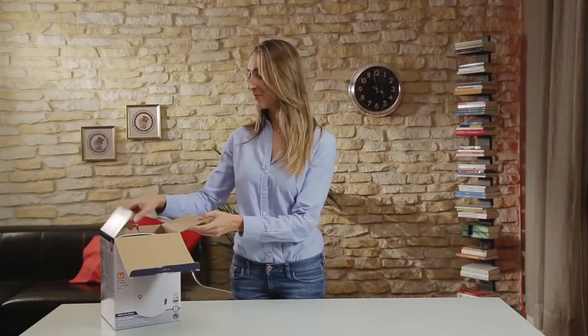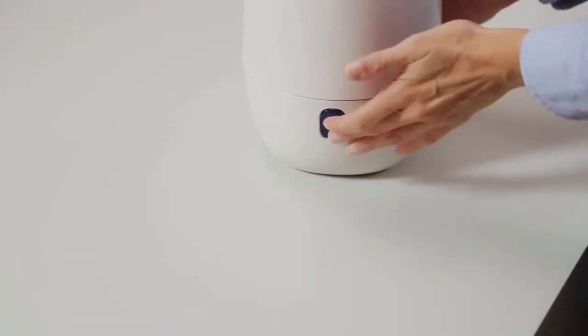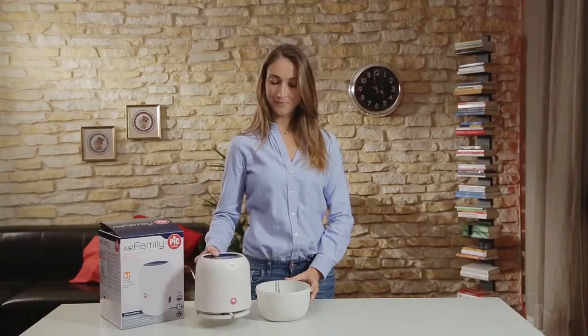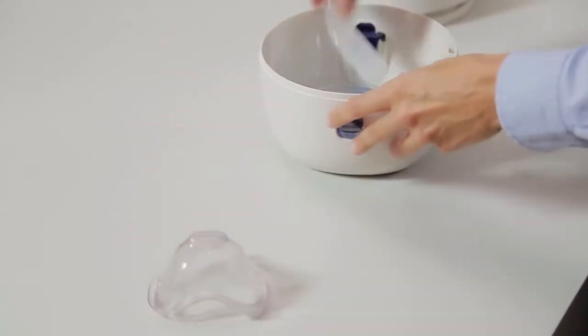Thanks to a convenient carrying handle, you can remove the nebuliser unit from its packaging. Find the two locking levers to open the product. Slide the levers inward and separate the storage compartment from the main unit. Remove all the accessories.